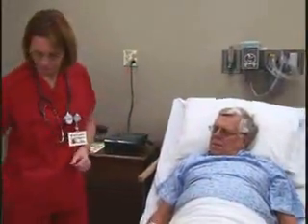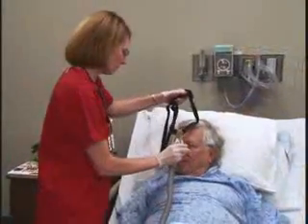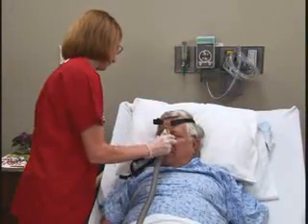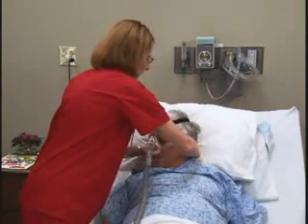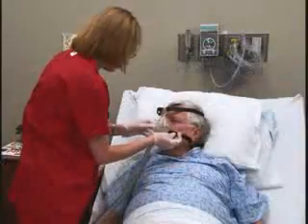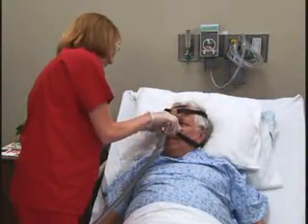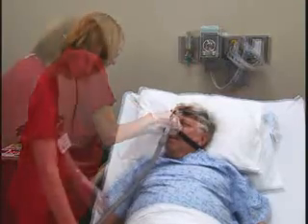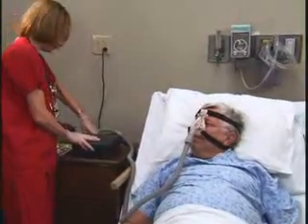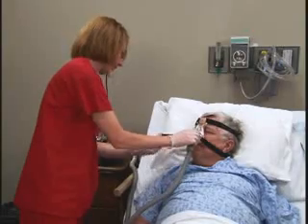Next, position the patient comfortably with his head elevated and apply gloves. Then place the mask over the patient's nose or face and adjust the head strap until the seal is as tight as he can tolerate. If needed, obtain a different type of mask so that it fits comfortably. Connect the CPAP or BiPAP tubing to the pressure generator. After instructing the patient to breathe normally, set the mask pressure as prescribed.